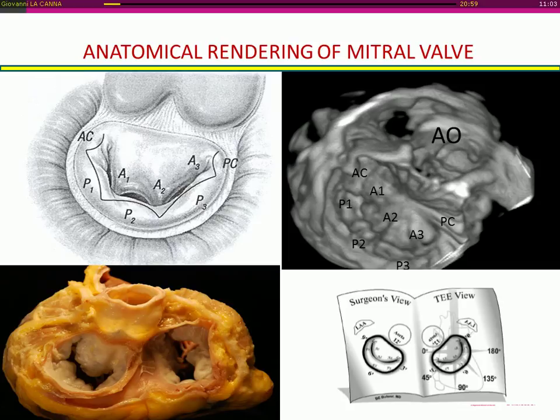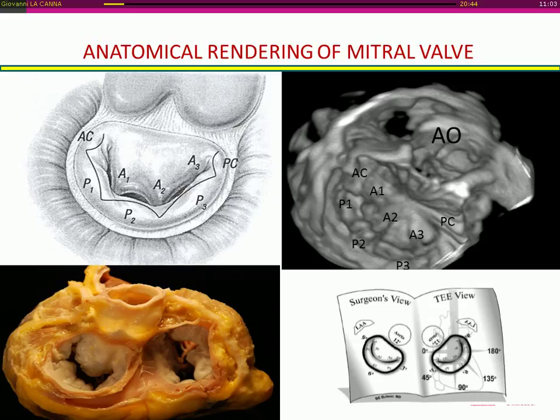One of the most important advantages of 3D echo is the possibility to image the mitral valve with anatomical rendering. This allows us to image the valve lesion according to surgical expectation and communicate the side and site of the valve lesion within the multidisciplinary team, including the operating room and cath lab, especially for percutaneous procedure guidance.